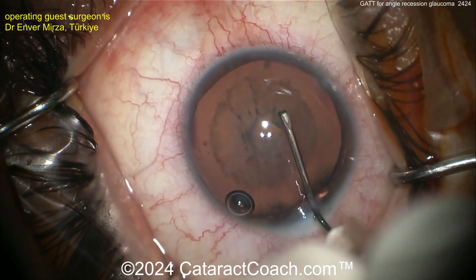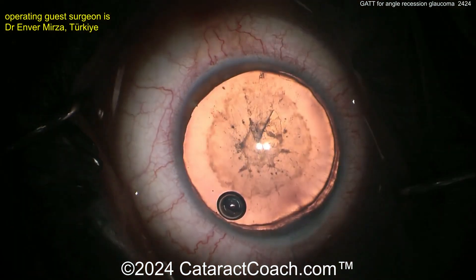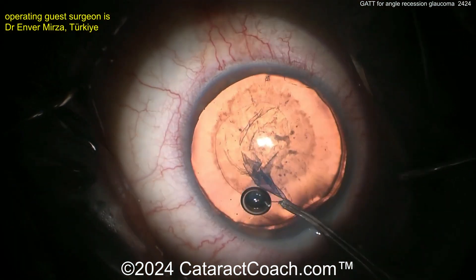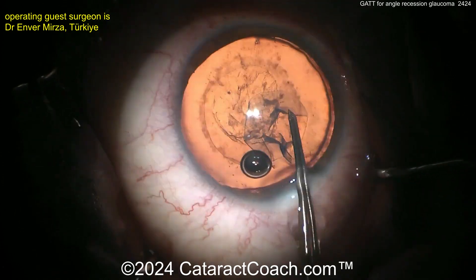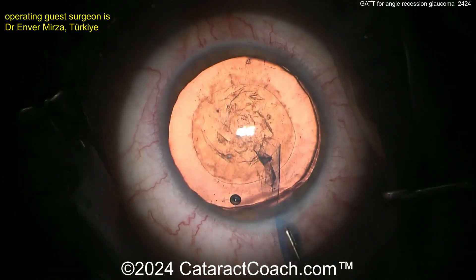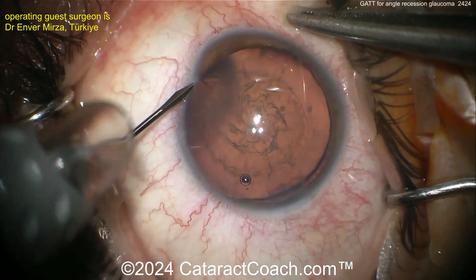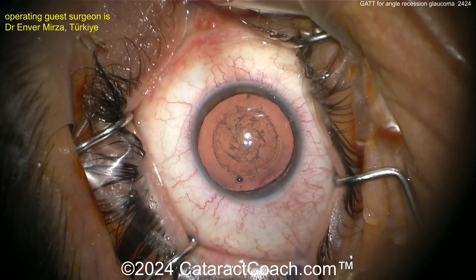You can see this is a classic traumatic cataract. Our surgeon is going in here getting a good capsulorhexis started well. I like the adjustment of the camera lights to the red reflex emphasis with the coaxial lighting. Beautiful rhexis, very nicely done. Now the cataract is going to be the easy part. Now what we have here — an extra incision going in.